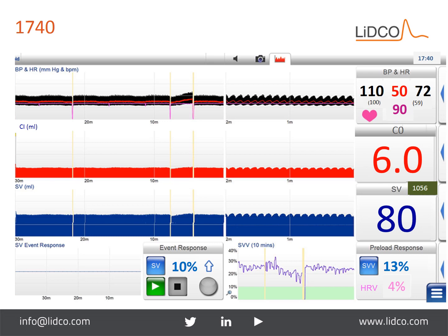I think we are in a very time-sensitive business. And you have this guy crumping in front of you, and you want to do something as quickly as fast as possible. Although I do believe it's prudent sometimes that we just stop, we wait, we let the patient declare himself or herself, and just let them equilibrate. And that's exactly what we did. And you can see here, by continuing with not titrating the norepinephrine drip, that the numbers look pretty good. But more importantly, our patient was looking better. And more importantly, collectively, these numbers are looking better. If we just isolated one number as we went through this case study, I believe it would have taken us down a path where we may have not managed the patient as quickly or as effectively or efficiently.